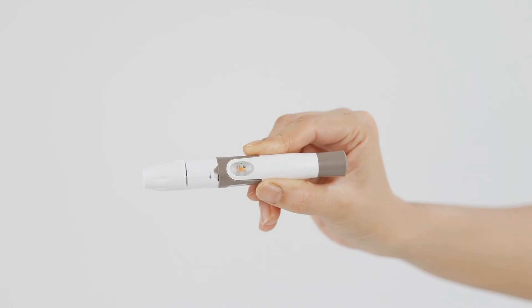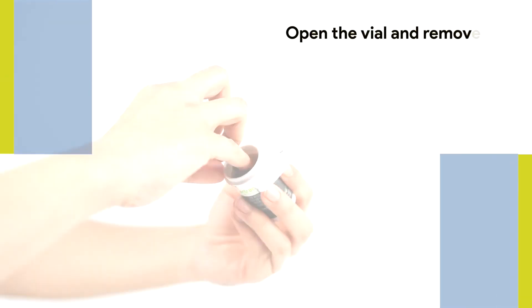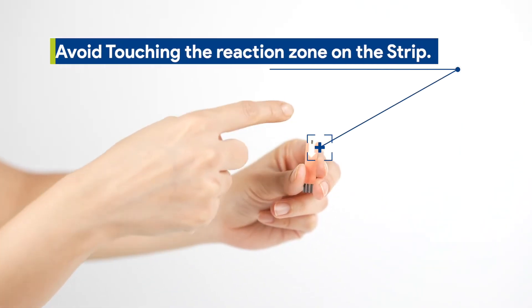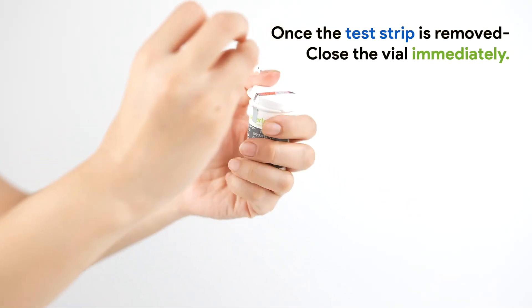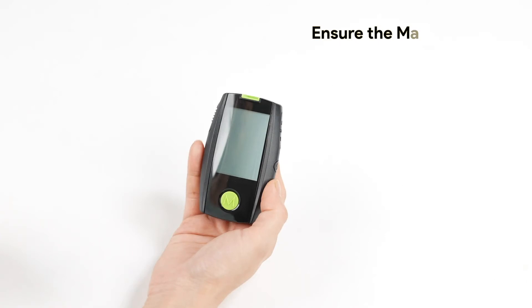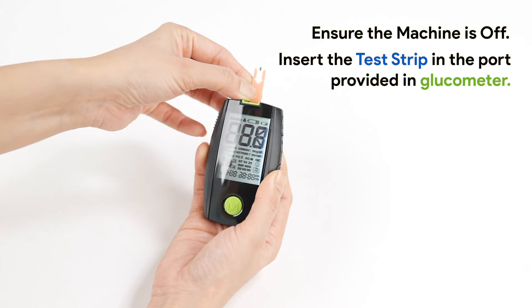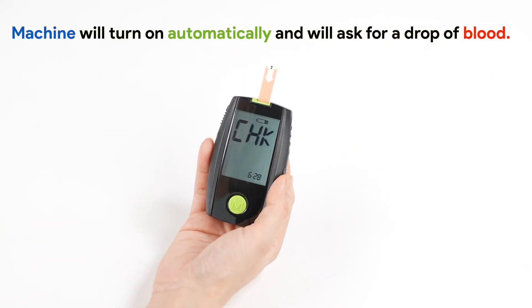Once you finish setting up the device, it's time for conducting a test. Open the vial and remove the test strip using your little finger. Avoid touching the reaction zone on the strip. Once the test strip is removed, close the vial immediately. The glucose test process must be completed within three minutes. Ensure the machine is off, then insert the test strip in the port provided in the glucometer. The machine will turn on automatically and will ask for a drop of blood.